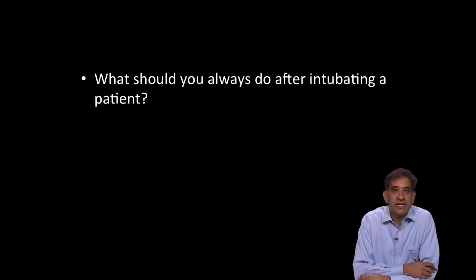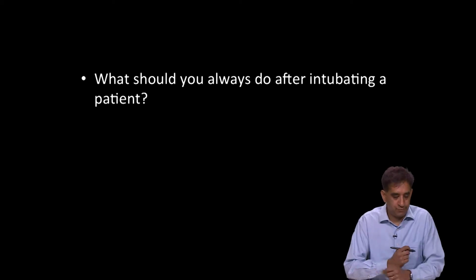So the tube's in, and now they're whisking the patient off to the operating room, but there are a few things that you always want to do after intubating a patient. So what should have been done immediately after intubating the patient? What are the things that we should be doing?